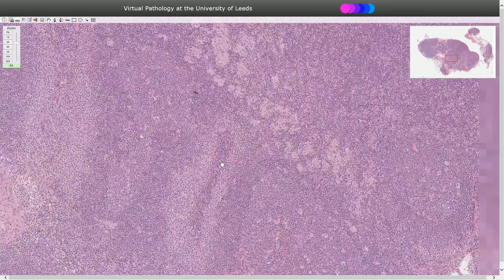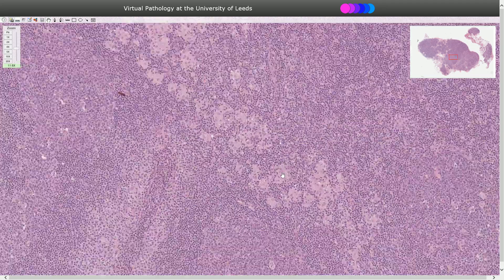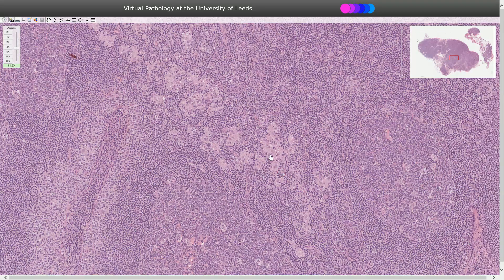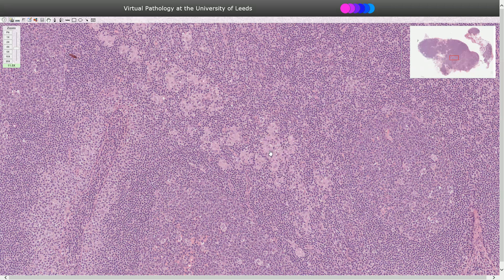The third sign is the presence of epithelioid histiocytes, which can be dispersed or form very small granulomas called micro-granulomas. These usually consist of fewer than 25 epithelioid cells, which distinguishes them from the well-formed granulomas seen in sarcoidosis. Unlike tuberculosis, we do not see necrosis.